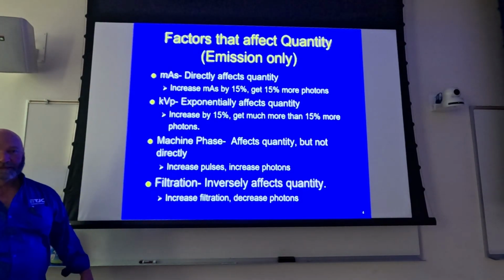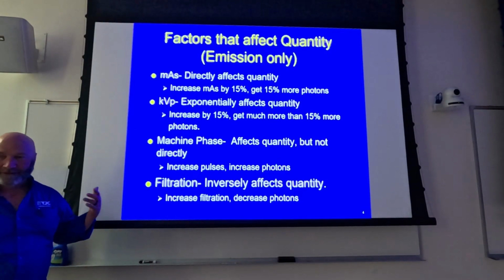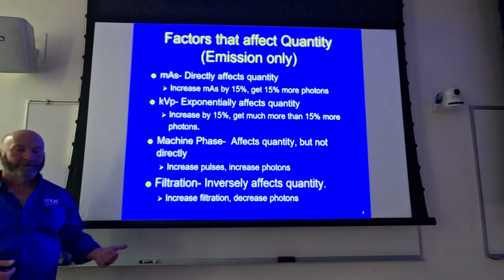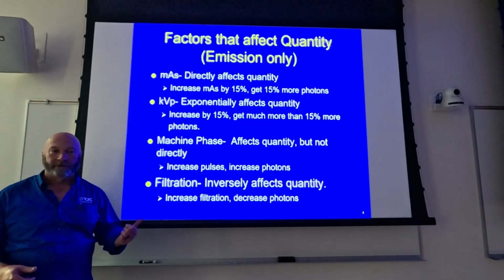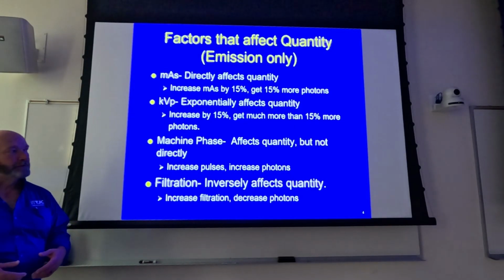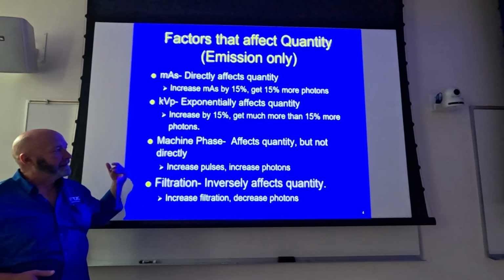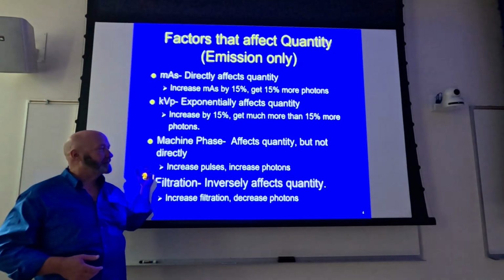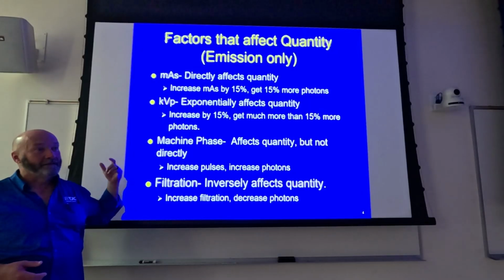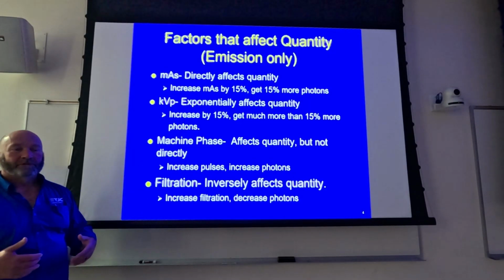Machine phase, I get it. Probably every machine that you're working with in the hospital is high frequency. So chances are, you're never going to work with a single phase or a 3-phase 6 or 12 pulse. You're just not going to, but you have to know this for the registry. With machine phase, what you get is an increase in quantity, and it is direct, but it's not direct in every way. Okay, so it goes in the same direction.